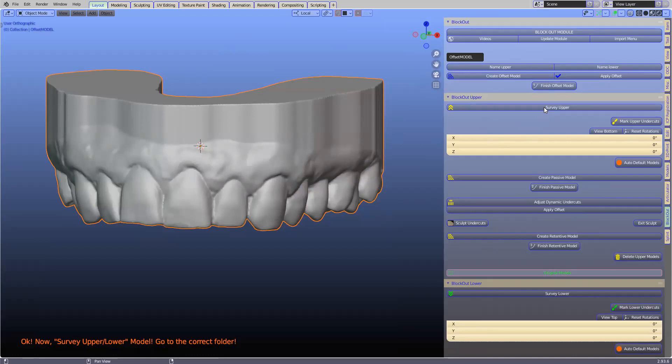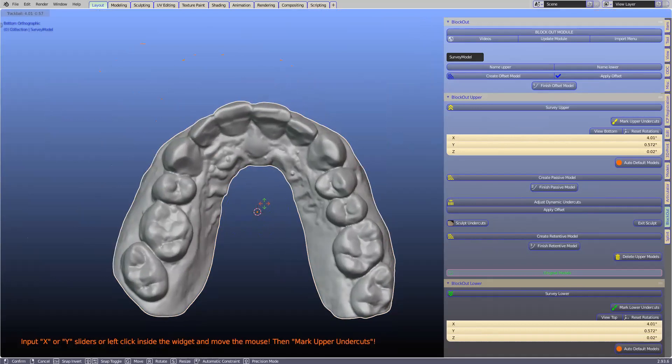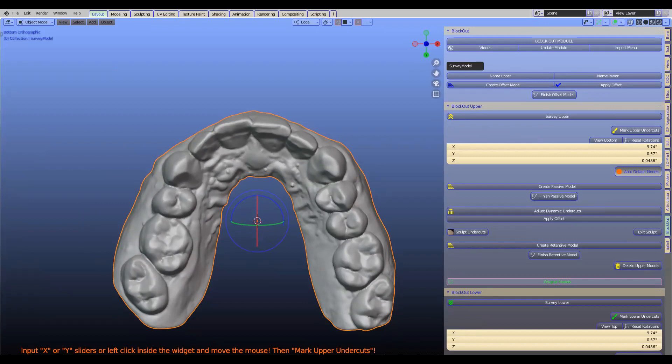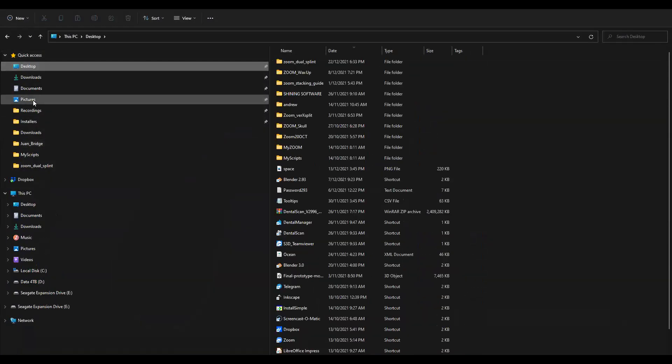Next we're going to survey this model. I'll look at it from the top and tilt it slightly — it's exactly like the survey table in the dental laboratory. Then we create all these models, which takes a little bit of time to calculate. I've recently adjusted it to get even more precise, which is why it takes a little longer.